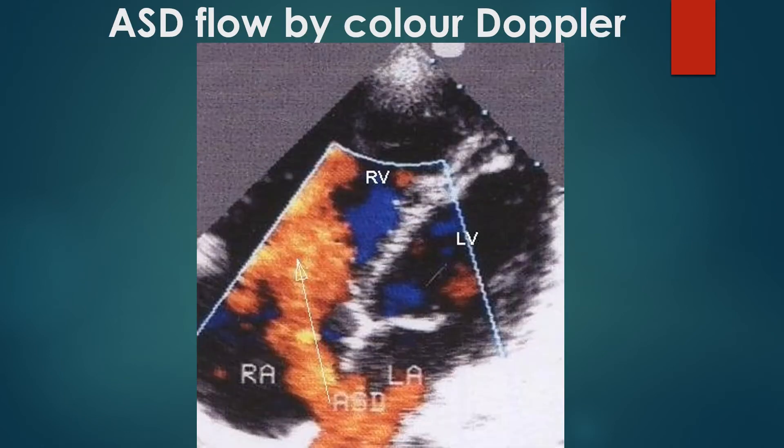Color Doppler flow mapping shows red-colored flow across the atrial septum from left atrium to right atrium. The flow is red because it is towards the echo transducer in this view. Blue-colored jet moving from right atrium to left atrium can occur when there is severe pulmonary hypertension. Transient right-to-left shunt can occur even without pulmonary hypertension during Valsalva maneuver.